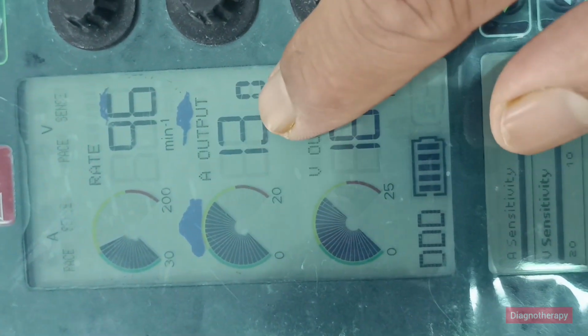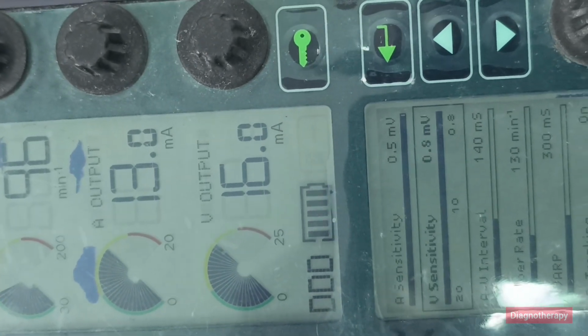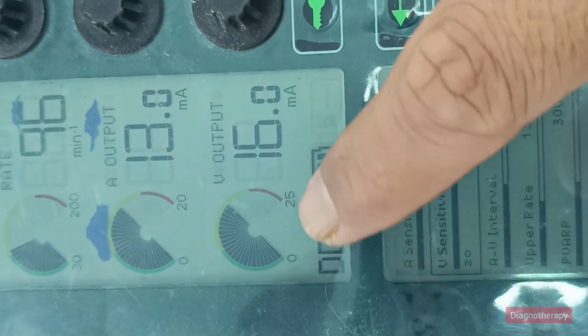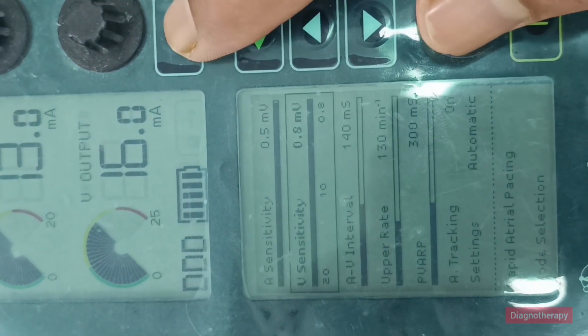This is the output of atrial. A is for atrial and V is for ventricle. So here all parameters and all the data is displayed. You can see milliamperes, then battery status. And this is the log function.